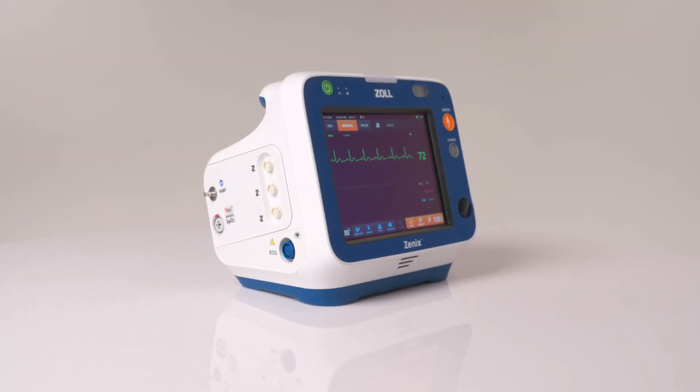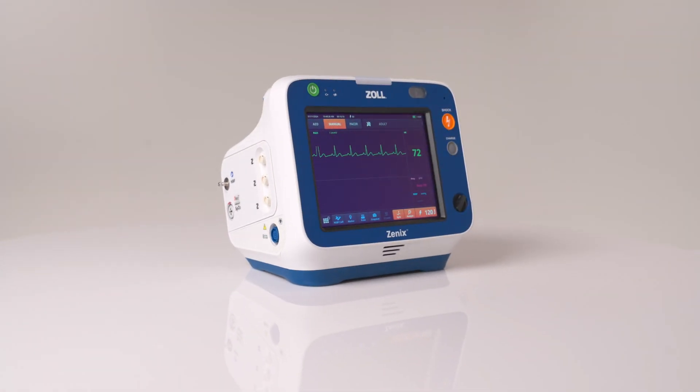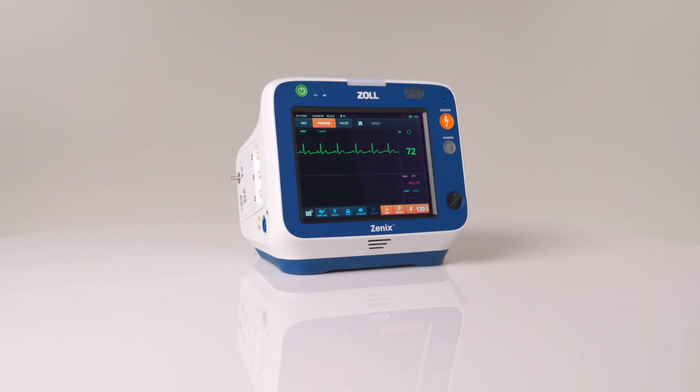We have now completed the basic device overview of the Zenix monitor defibrillator.